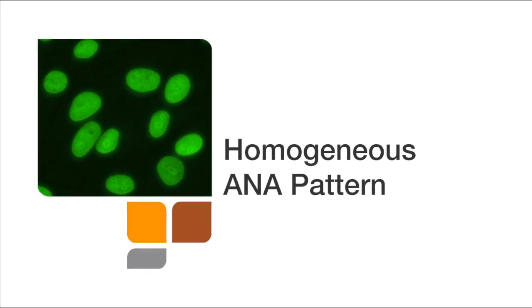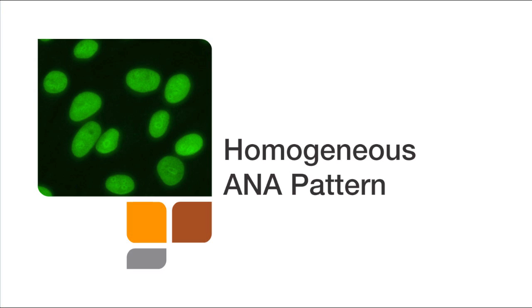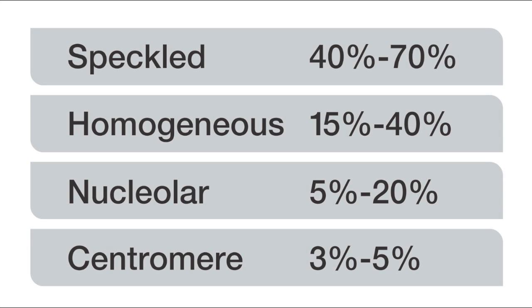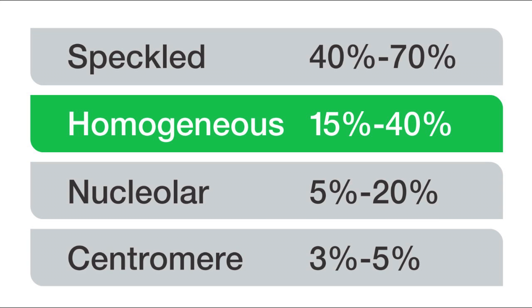Today in this video, we will be analyzing the step-by-step process in interpreting a common ANA-IFA pattern and its clinical significance. The IFA pattern for today is a homogeneous pattern. The homogeneous pattern is a common ANA-IFA pattern and is seen in about 15-40% of IFA-positive samples.